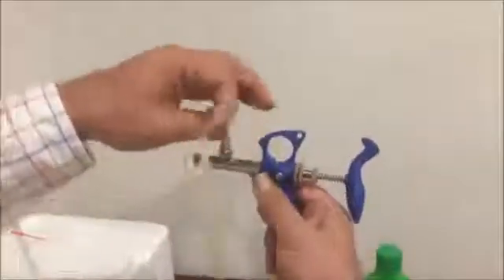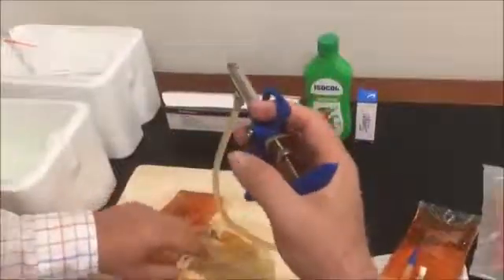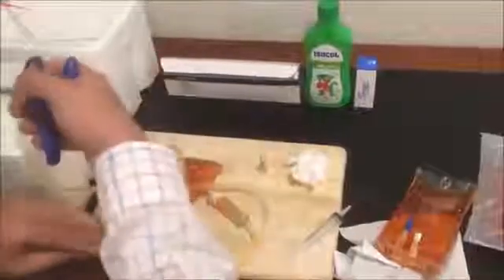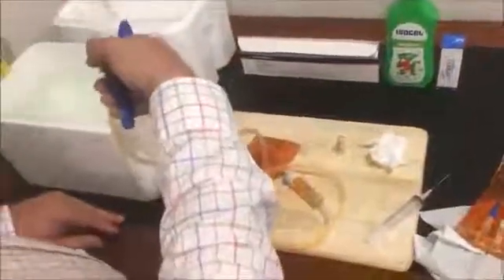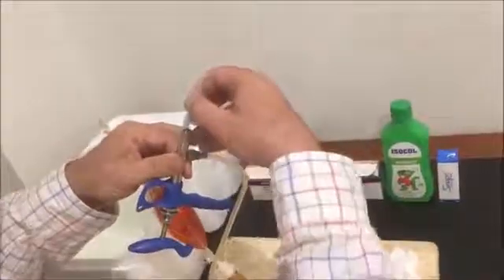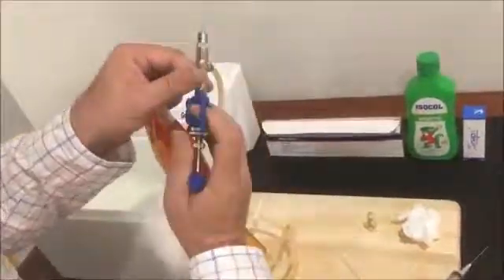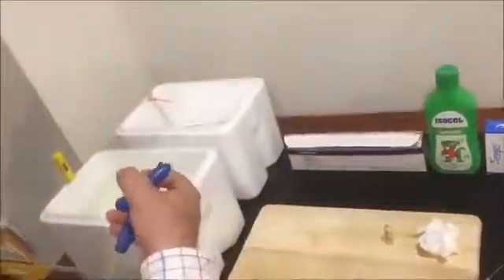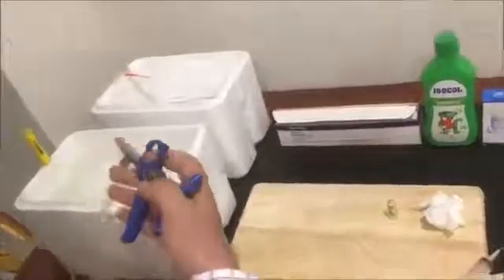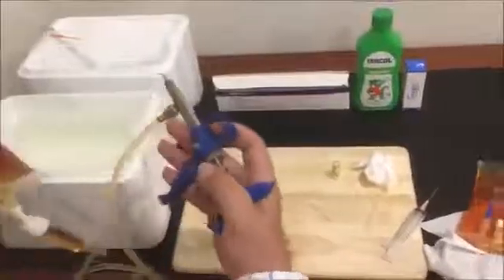Connect it up to the vaccine gun and to prime the vaccine down, turn the clamp off. Keep the vaccine bag up and put a needle on the end. This is a smaller needle and the injection will go through it. We're doing about 0.2 to 0.4 mils per injection into the chicken.